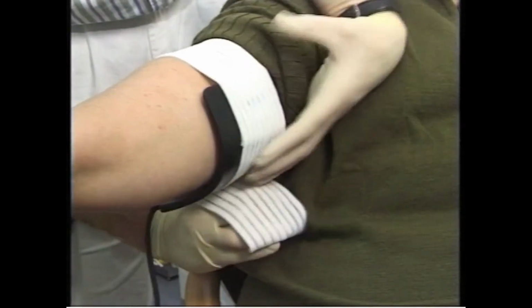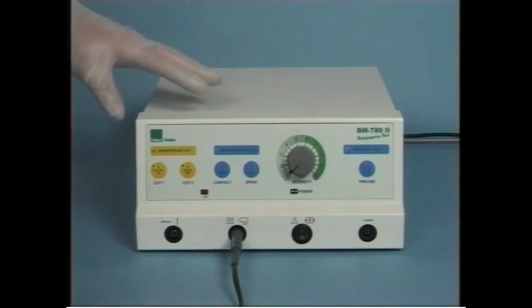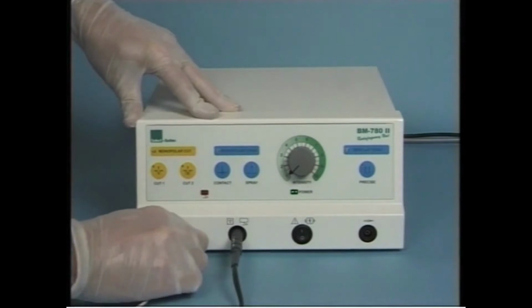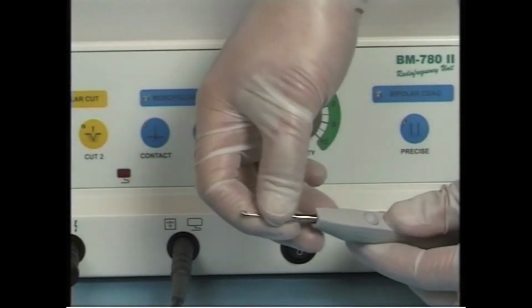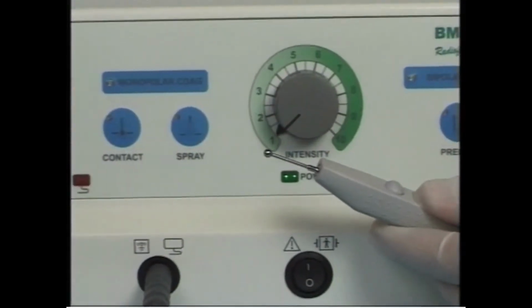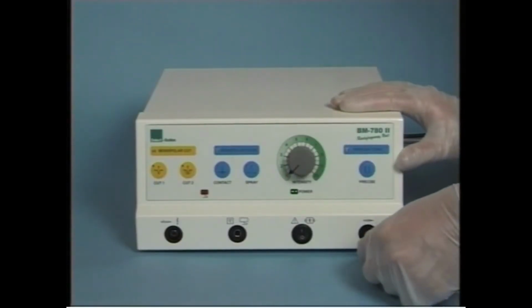Connect the required operating pencil to the generator. Put the plug for the monopolar operating pencil or for the monopolar foot-activated electrode into the appropriate socket on the front of the device. If necessary, put the active electrode into the pencil. Use the bipolar cable to connect the bipolar electrode to the appropriate socket on the front of the device.